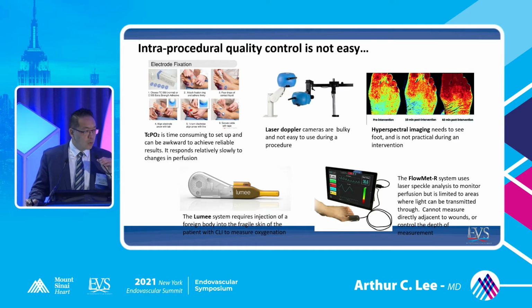TCPO2 is older technology. We actually don't even have it at our hospital anymore. It takes time. You have to warm up the probes. A good study takes 45 minutes. It can be hard to reproduce. Laser Doppler cameras can be bulky. It's more of an experimental protocol at this time.